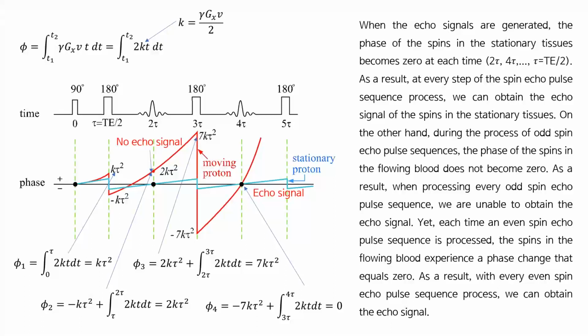Now let's see what the even echo rephasing and odd echo dephasing are. This is the phase equation from the previous slide.